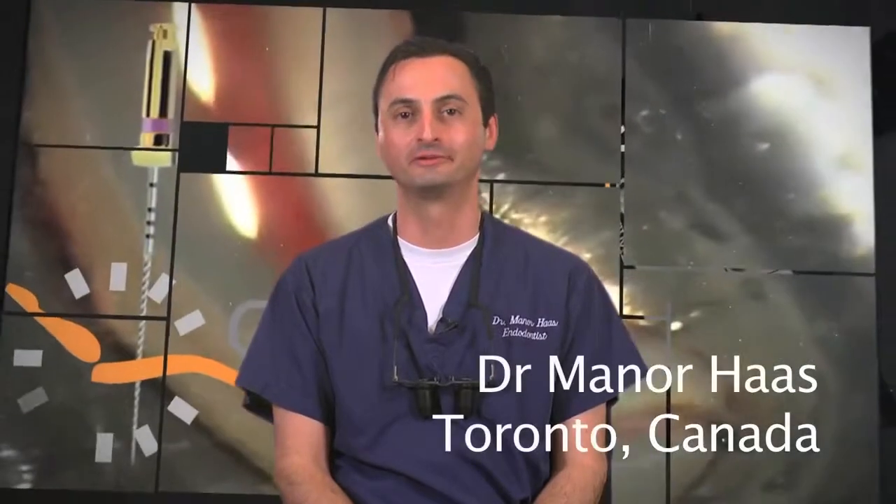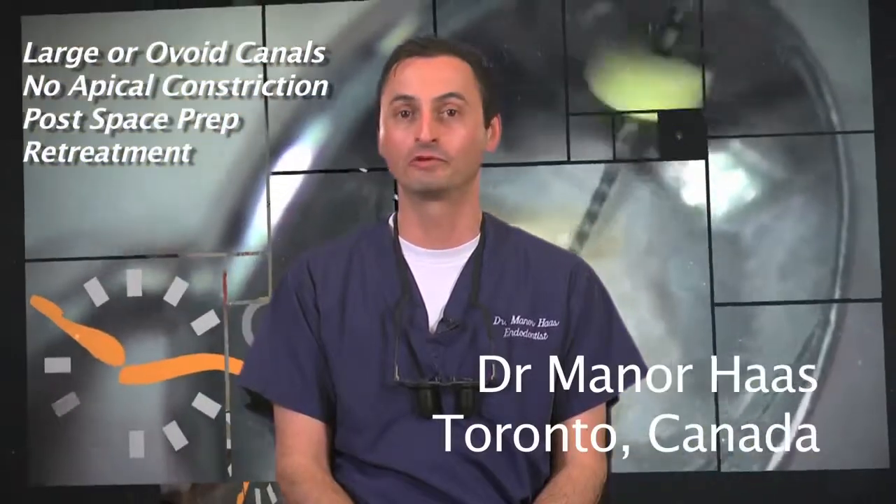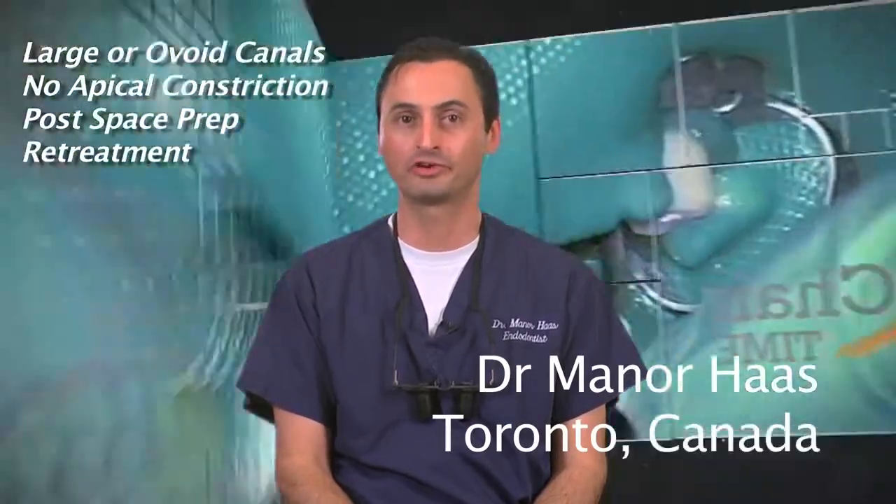Hello, I'm Dr. Menor Haas. I'm a certified endodontist from Toronto, Canada. In this segment, I would like to review the management of large or ovoid canals, canals with no apical constrictions, post-space preparations, and re-treatment of gutta core. First, I'll speak about obturation of ovoid canals.